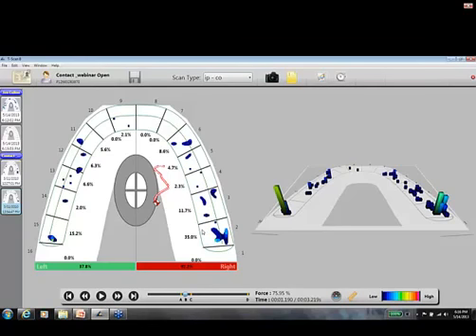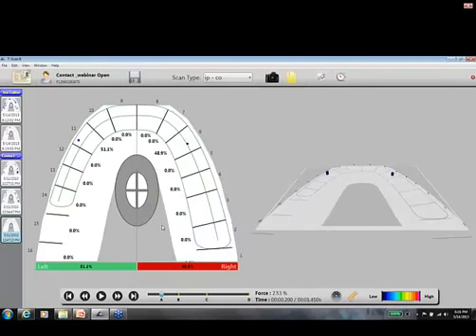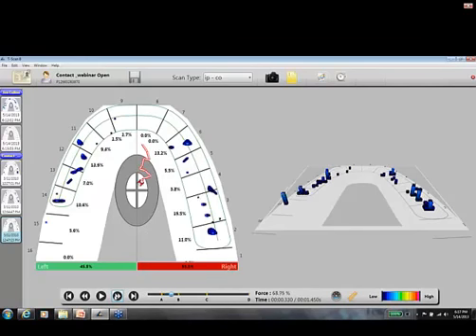We now go in with paper. We mark it up. We know we're going to number 2 and number 15. And let's see this, 1247 we'll go to. So this whole process was 20 minutes. Now the patient comes into their bite, and where we ended that day was here.